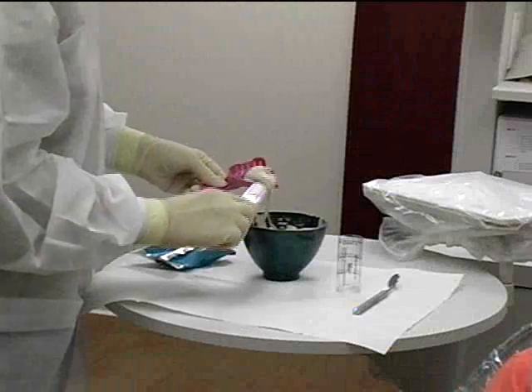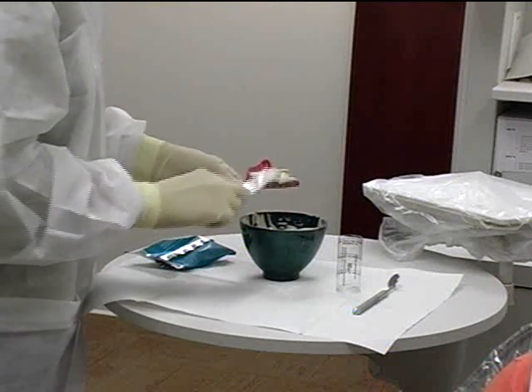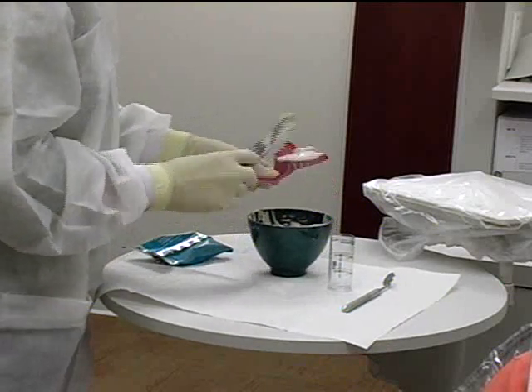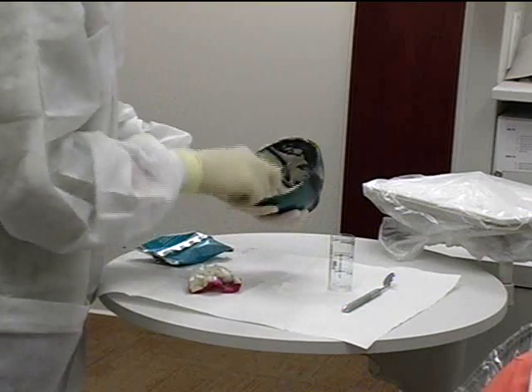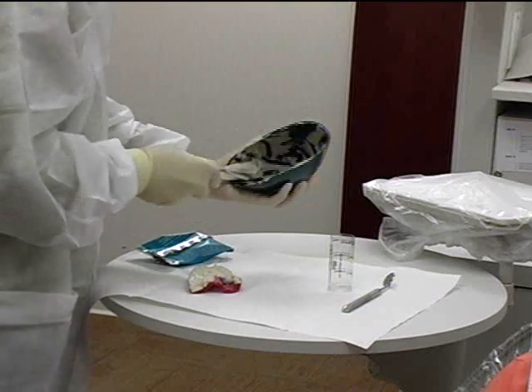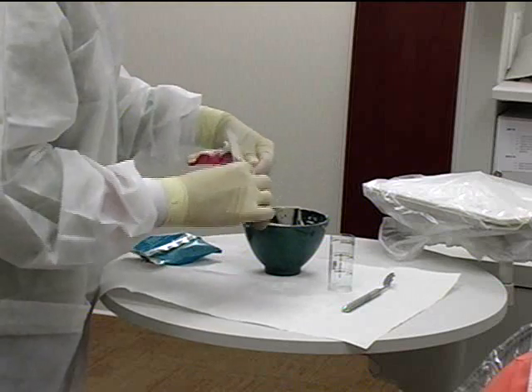Load the tray with alginate, beginning at one side. Carefully fill the tray without trapping air and without excess material at the posterior border.